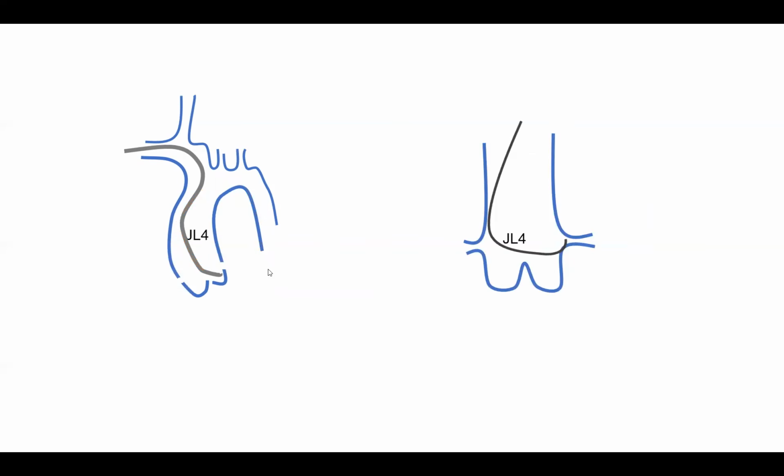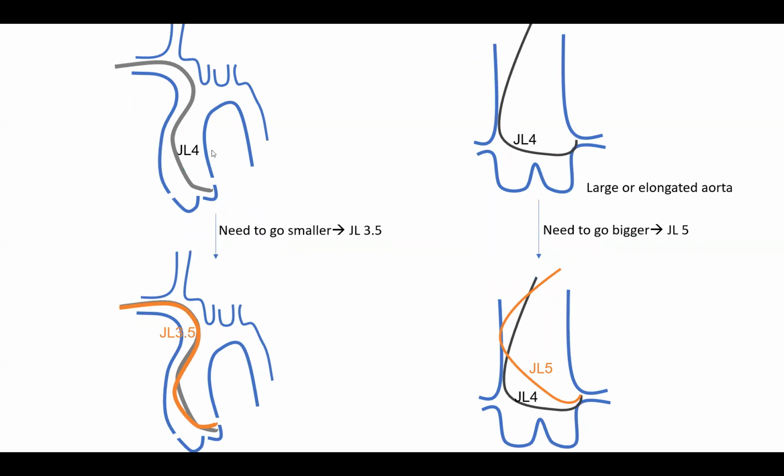Another important tip in general from any approach, femoral or radial: whenever you see a catheter straightened and elongated with its tip pointing down, you need a shorter arm to engage. Conversely, when you see a catheter falling down and shortened, looped on itself with its tip pointing up, you need a longer arm. This is how I illustrated.